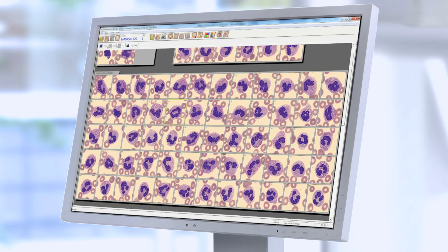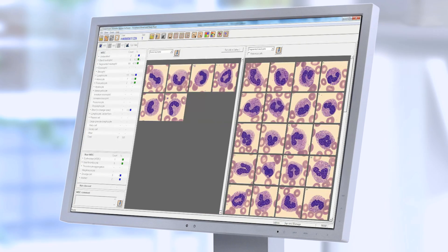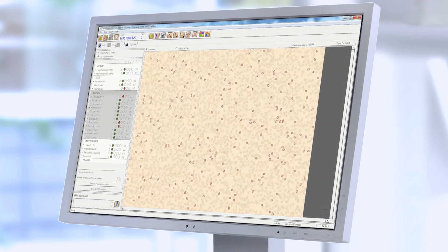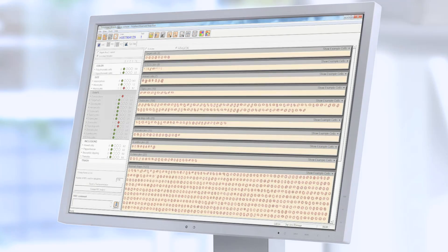Structured interfaces, smart functionalities, and embedded tools help speed up the review process while promoting accuracy and consistency.